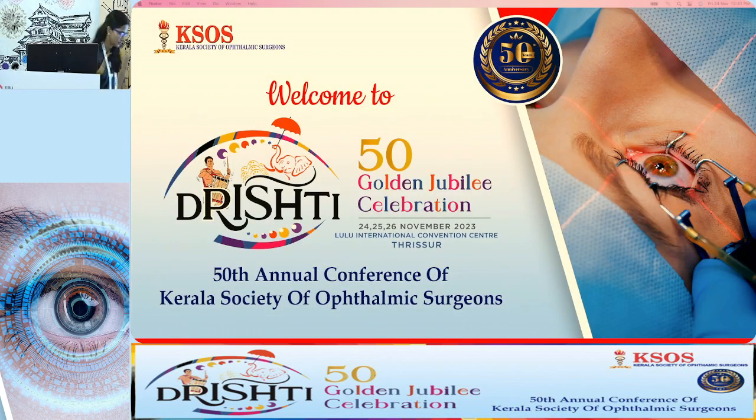Thank you, Dr. Sarita, for your elaborate but basic talk on how to do a gonioscopy. Because gonioscopy is critical in the diagnosis of all forms of glaucomas, which will give information about the increased intraocular tension, and also it is critical to see the potential causes, determination of therapy. So for therapy as well as cause of increased IOP, you can find out by gonioscopy. So all general ophthalmologists should know how to do a gonioscopy.